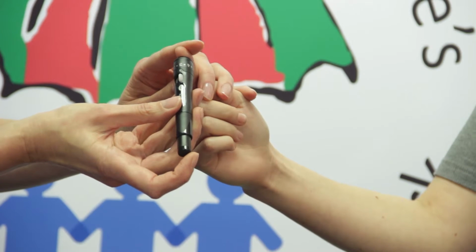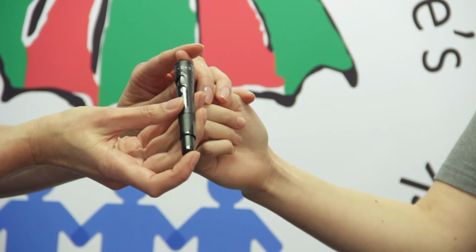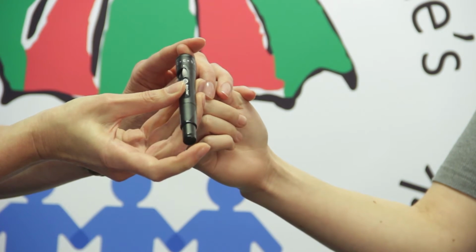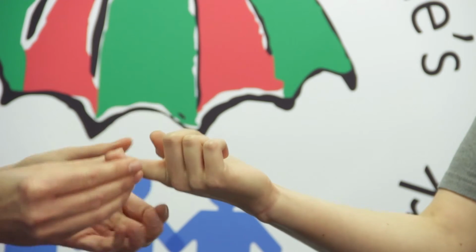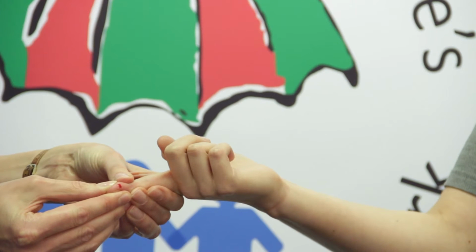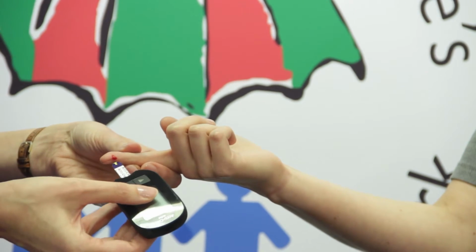When you put the lancet device against the finger, you don't need to press firmly, you just need to make sure that there is good contact between the lancing device and the finger. Once you've lanced the finger, you then need to squeeze the tip to get a drop of blood. And then you apply the drop of blood to the end of the strip.